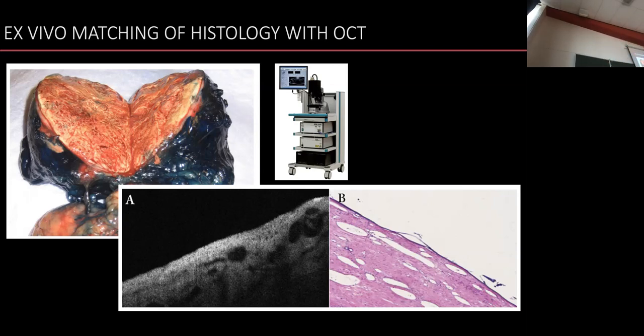We started this work a long time ago, where we studied a kidney, a fully tumorous kidney. In this kidney, it was clear cancer, and not just part of the kidney, but the whole kidney. But it was ideal for us to study what the differences are that you can expect already ex vivo, where we put a little bit of tissue under the OCT system, take that tissue, process it in microscopic slides, give it to the pathologist and compare these data sets.